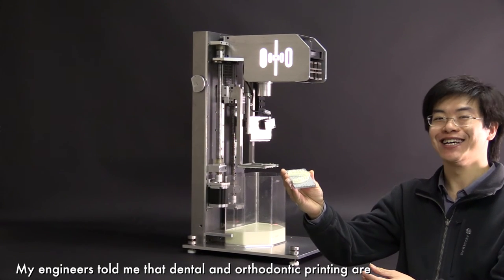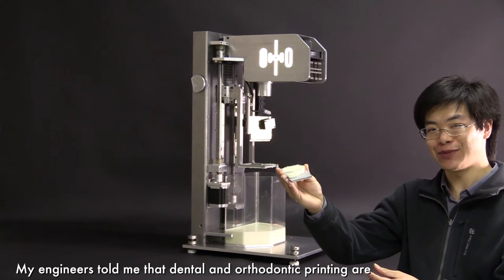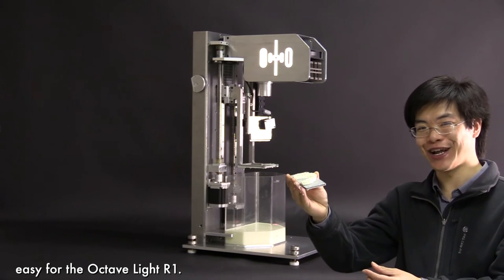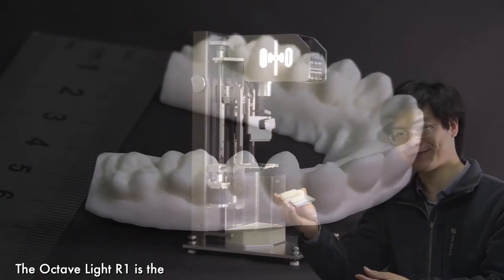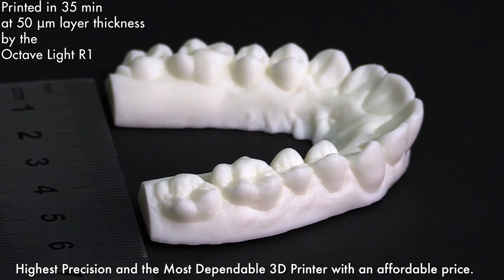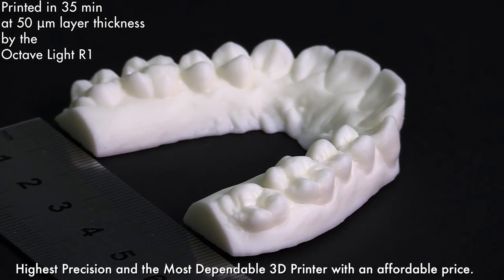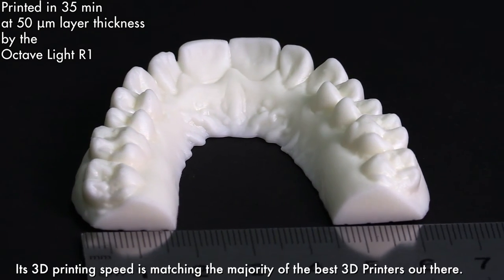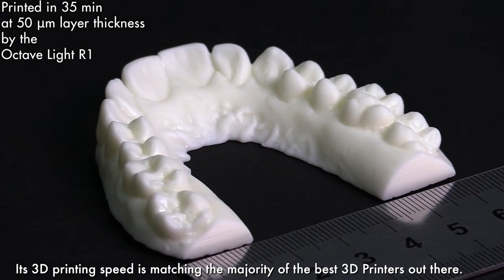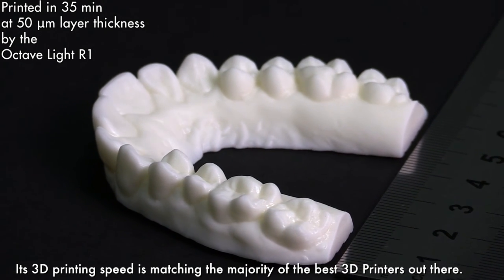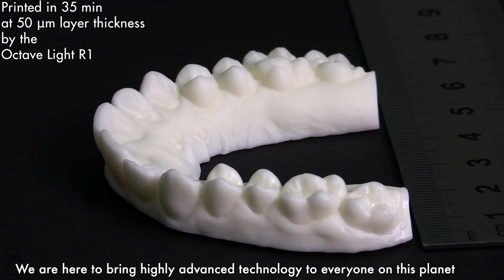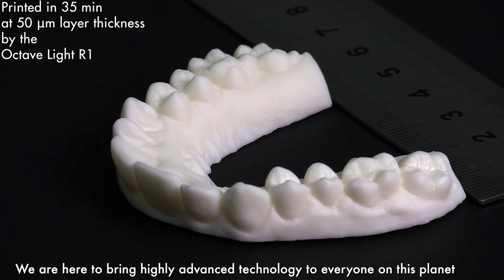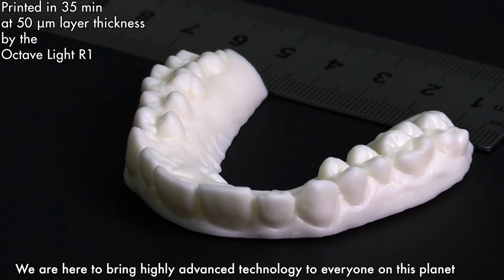My engineers told me that dental and orthodontic printing are easy for the Octav Light R1. The Octav Light R1 is the highest precision and the most dependable 3D printer with an affordable price. Its 3D printing speed is matching the majority of the best 3D printers out there. We are here to bring highly advanced technology to everyone on this planet at the lowest price we can manage.